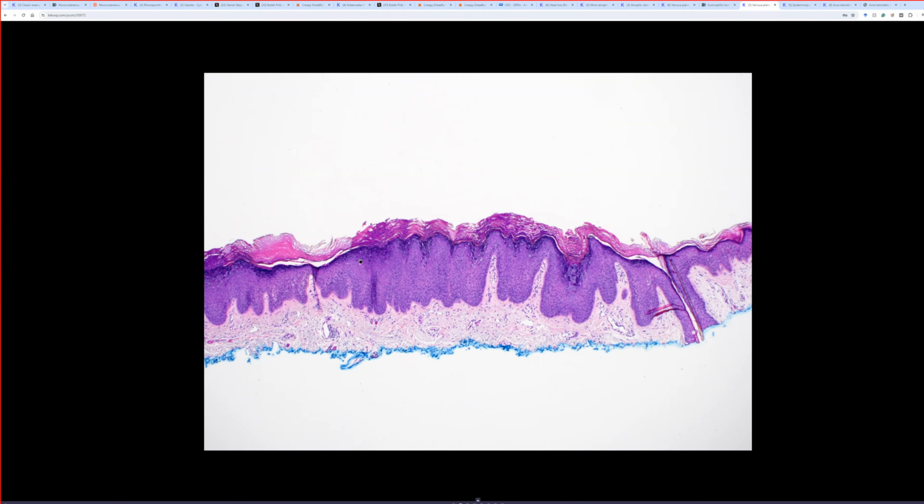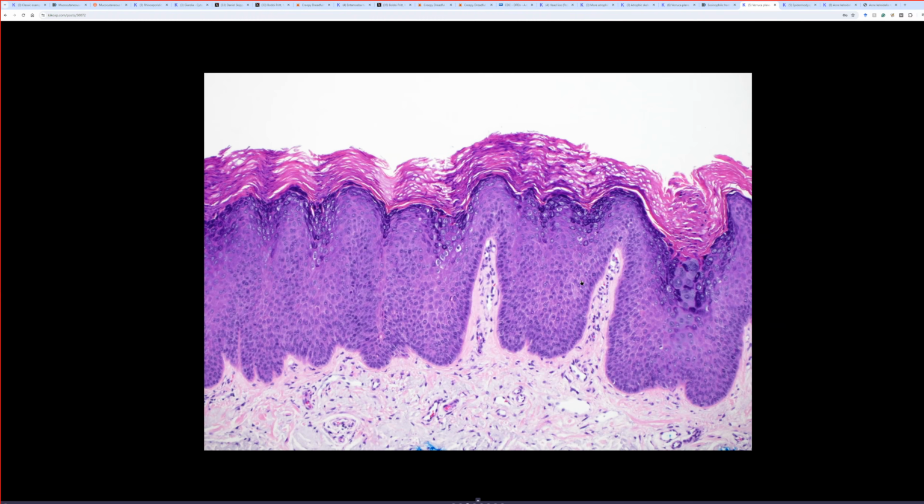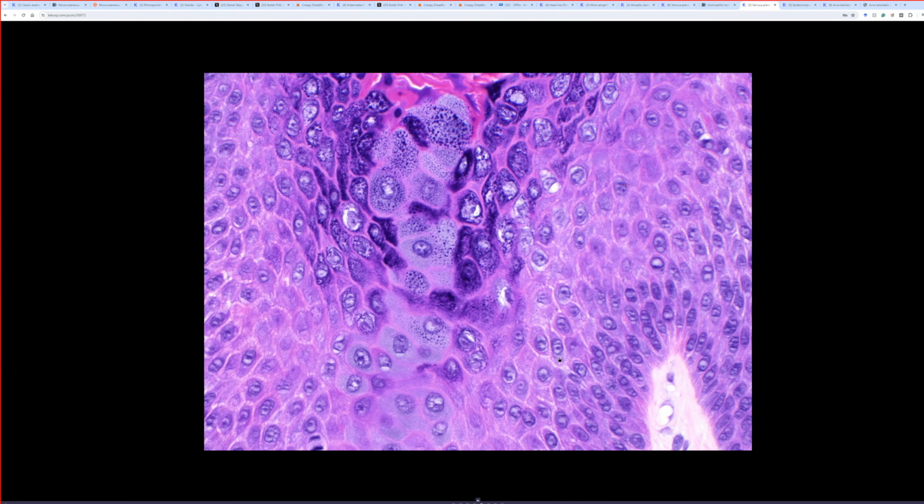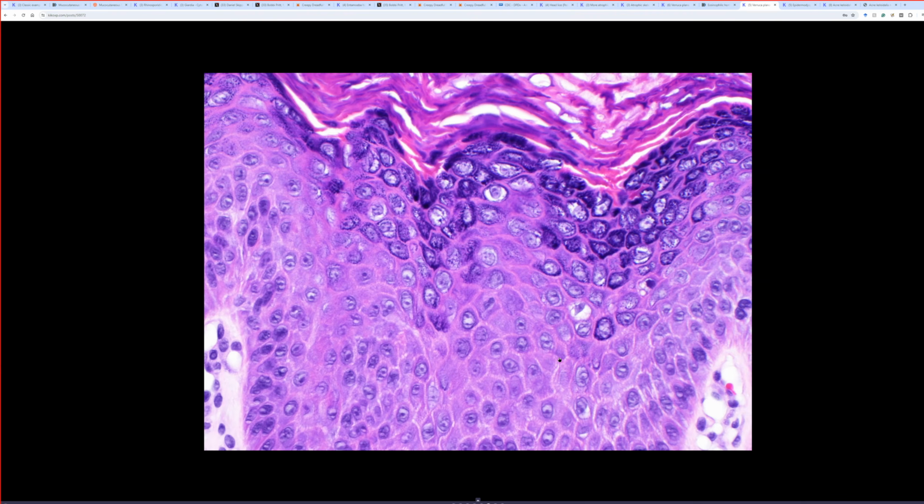So this is another example. That was a different case. Here's another case. I'm just showing a few examples. Here's one where you've got some Verruca plana here, and then focally in that same Verruca plana, you can see that blue-gray epidermodysplasia verruciformis EDV type cytoplasmic change. So regular flatwort Verruca plana over here on the left, and then on the right, the EDV subtype. So they can coexist together. Isn't that nice? I just think it's kind of fun.